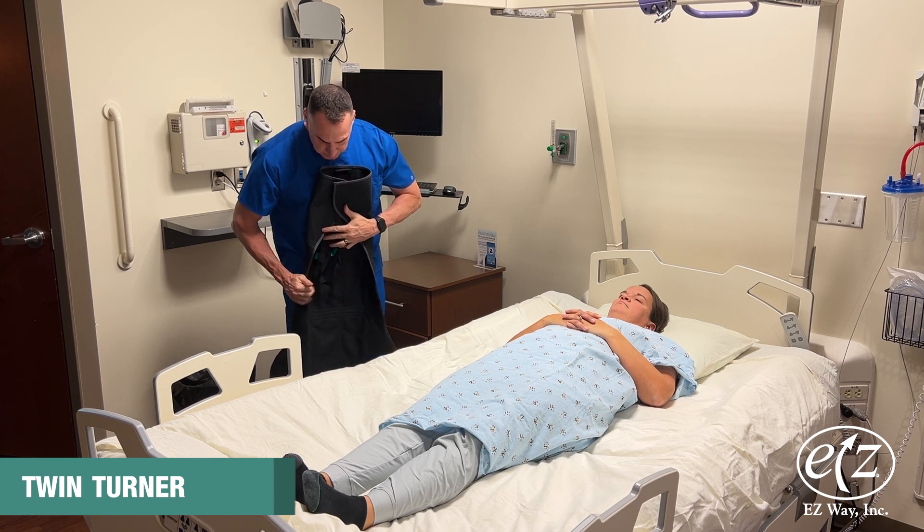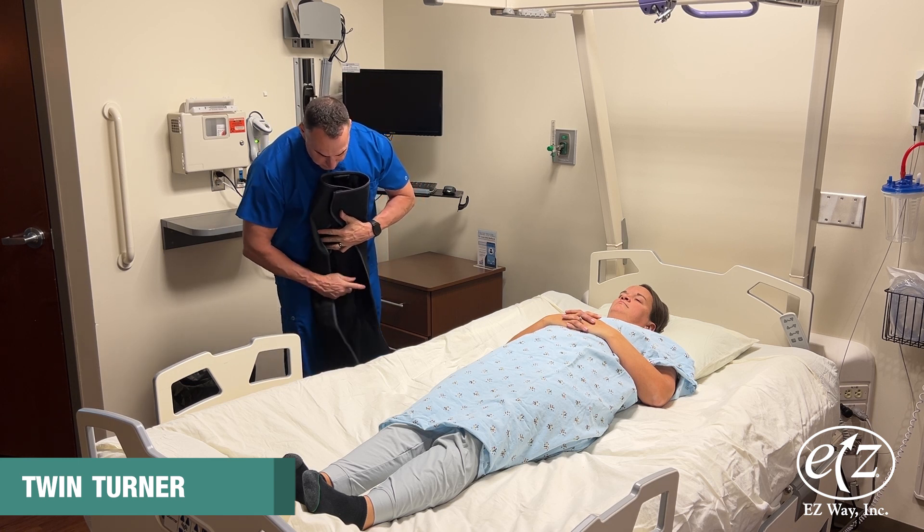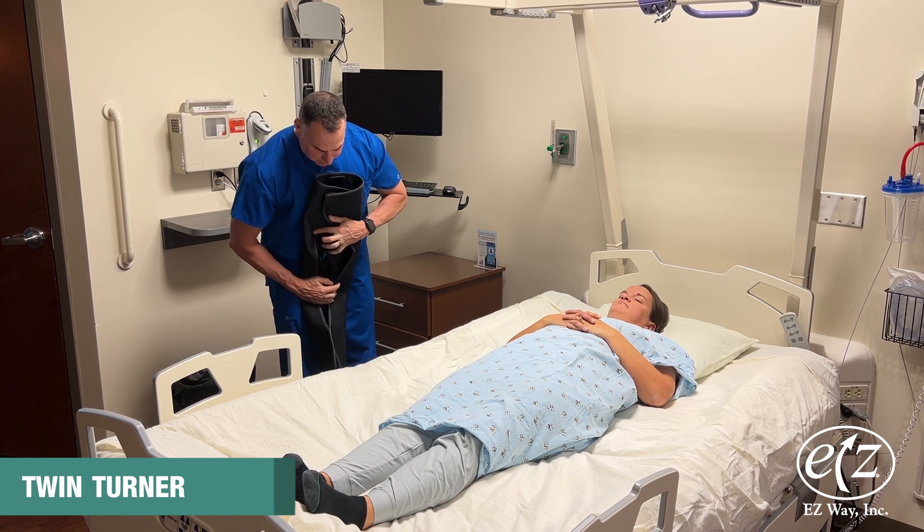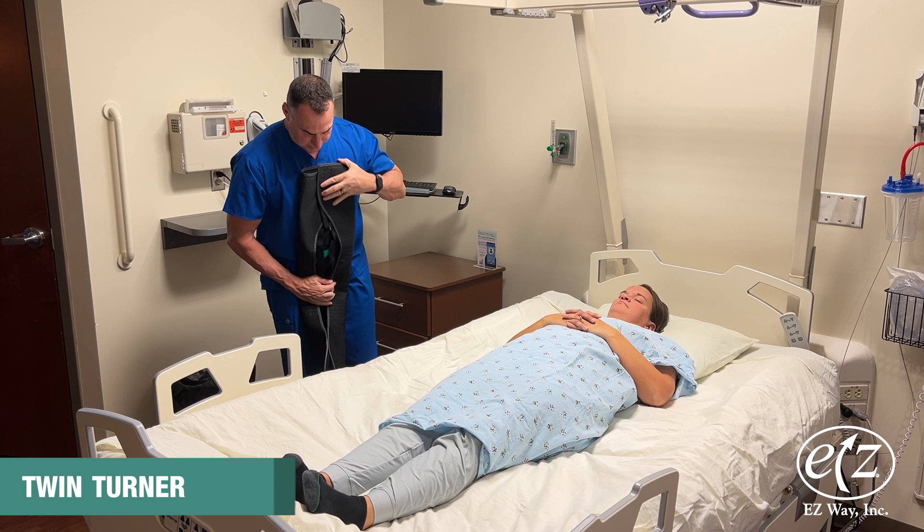While holding onto the folded corners, use the other hand to grab toward the middle of the sling, ensuring that the straps are tucked underneath the fabric.